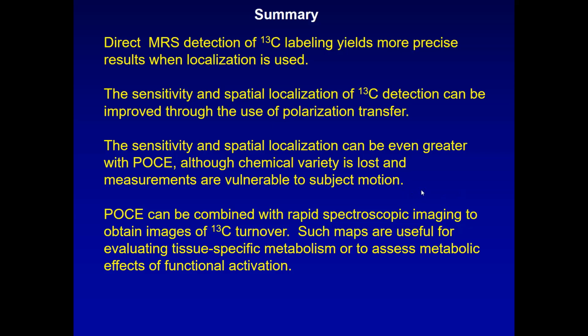It's very important to have people situated comfortably with padding that is firm enough to help hold them in position so they can relax, but not so firm that they feel frozen. We also lose chemical variety with POCE. We can't see as many chemicals as we could have if we were doing carbon-13 spectroscopy, but depending on your application, it can be worth the sacrifice.